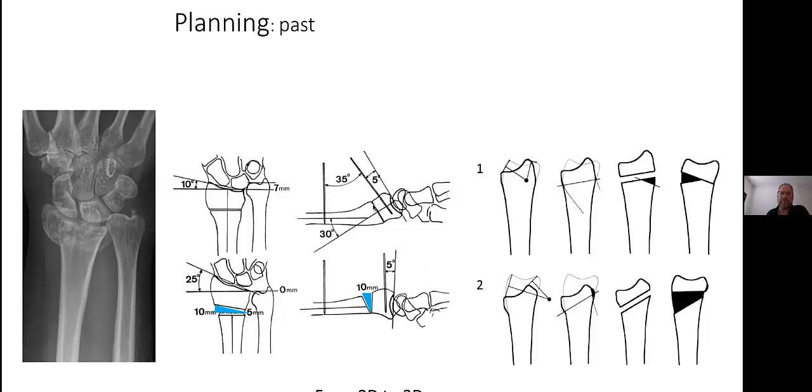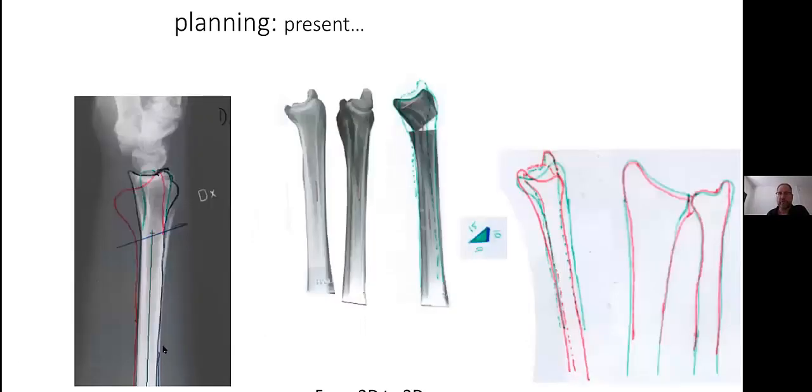And angles are not so difficult. I mean, even for me, I can measure this and recreate it, but when it comes to rotational deformities, it's a totally different ballgame. You see here, it's basically a tube, and it's very hard to see. Even on CT you can understand it, but it's hard then to recreate. So what is basically done, actually, I'm a bit embarrassed, it's still done like this.